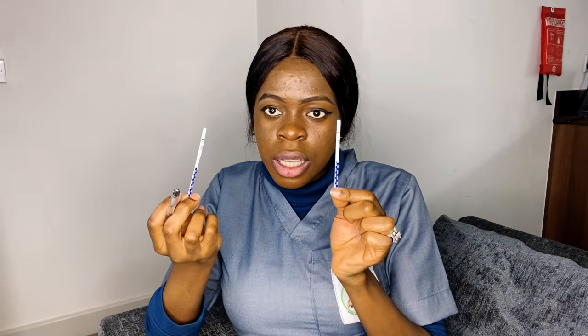Then 1 line, you can see this one is 1 line. I just pray you can see this. So this one is 1 line. 1 line simply means you are not pregnant. So the difference between this strip and this strip is the lines in it. This one shows that she is pregnant. Then this one shows that she's not pregnant.